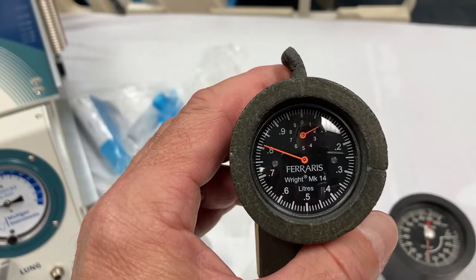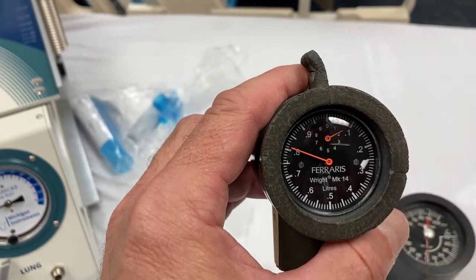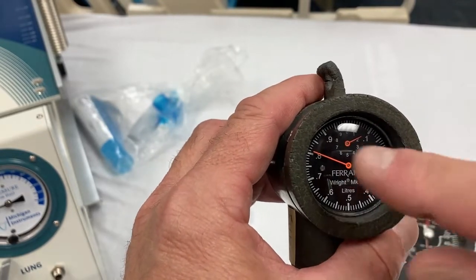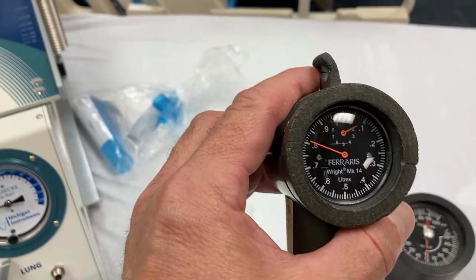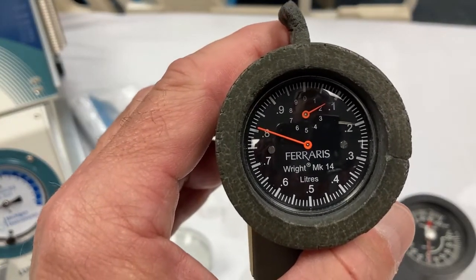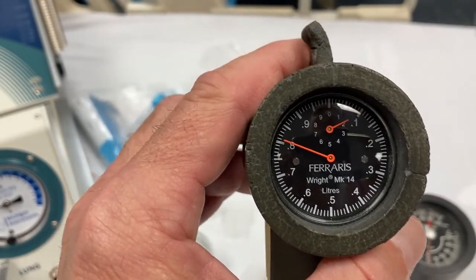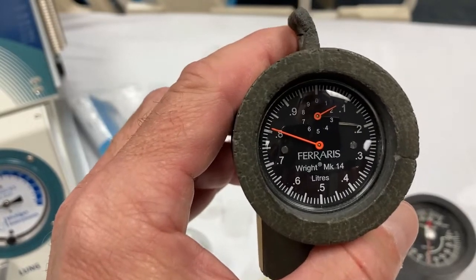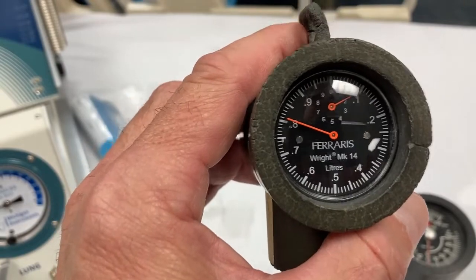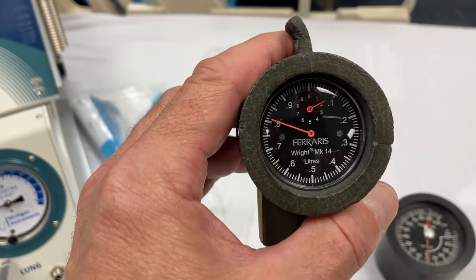So when you're done, you're going to pull it off and you're going to read the minute ventilation. Now this has two little dial areas on it. The inner one is whole liters and the outer one is the partial liters. So if we look at this one, you can see that the little one is just before the 2, so it's going to be 1 point something. And if we look on the outer one, it's right about at the 0.8. So that's 1.8 liters or 1,800 milliliters, whichever you want to report it as. I would do liters, 1.8 liters. And so that's that.